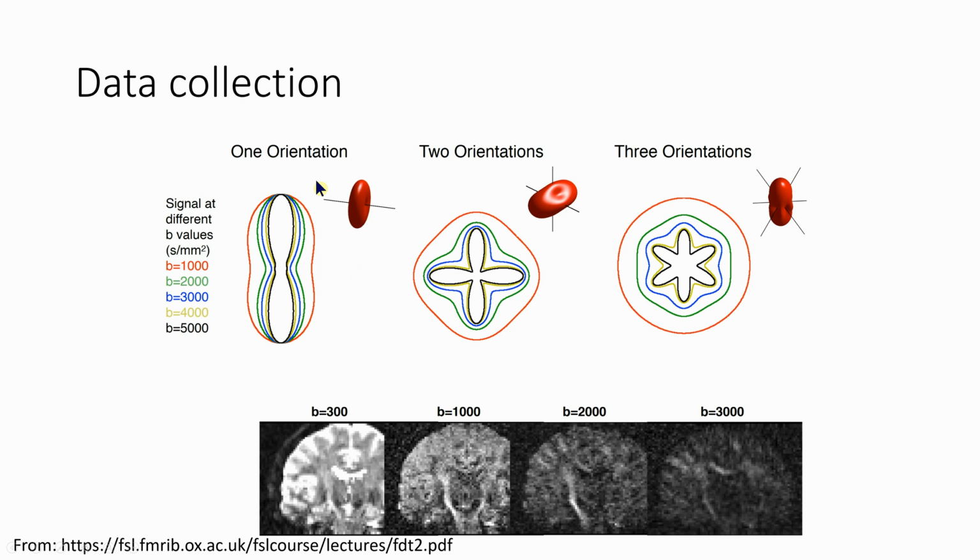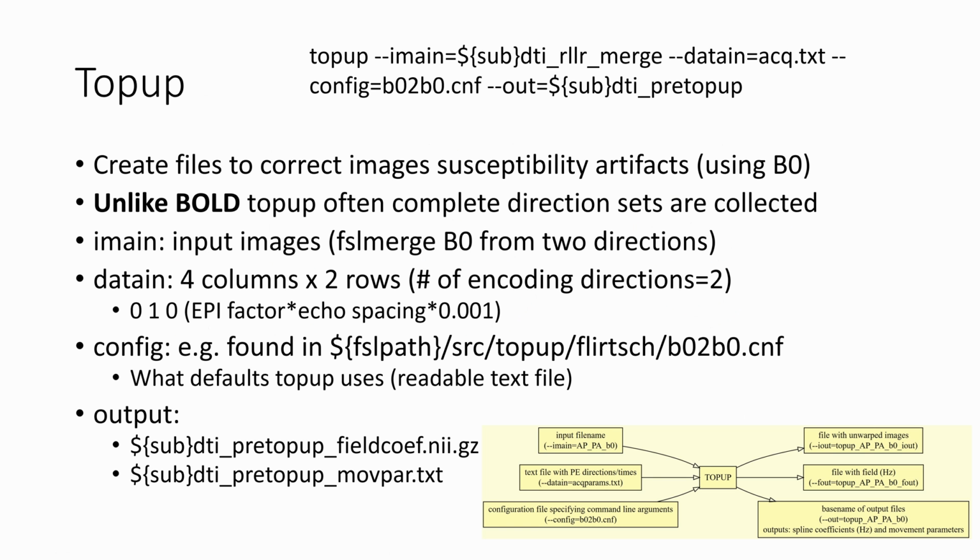And one of the things, and this is his second lecture, he discussed, you've got your concern about orientation. If you have a singular orientation, then it's not so difficult, but as they start to path through each other and create more complex images, then you get an increasing failure of those low B values that aren't able to really look down that directional path, and you get the increasing benefit and accuracy of the increased B values. So collecting more tensors along those where they have more directional input and lower signal to noise is not a bad idea. So going back to what we were talking about, how you dispense across your shells. Any questions on that?